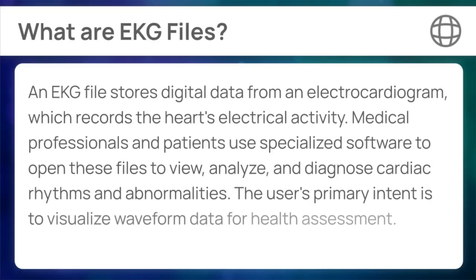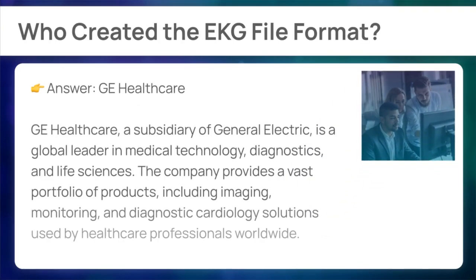An EKG file stores digital data from an electrocardiogram, which records the heart's electrical activity. Medical professionals and patients use specialized software to open these files to view, analyze, and diagnose cardiac rhythms and abnormalities. The user's primary intent is to visualize waveform data for health assessment.